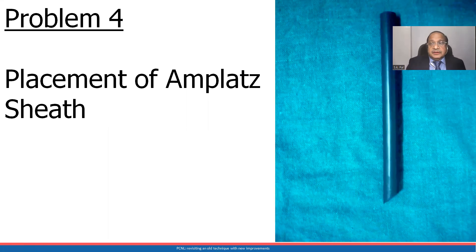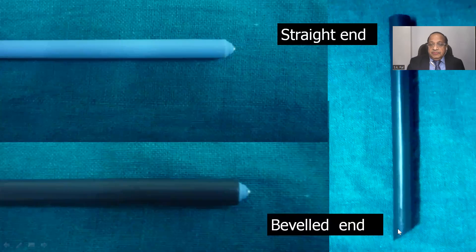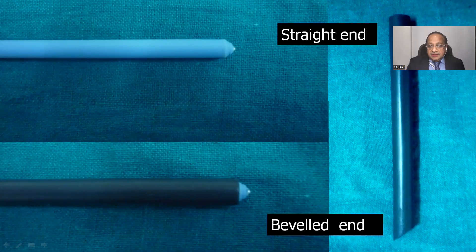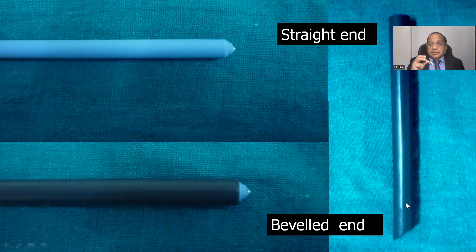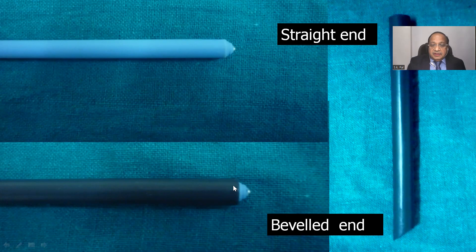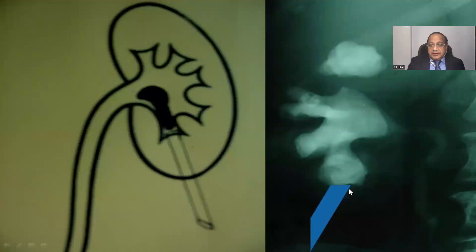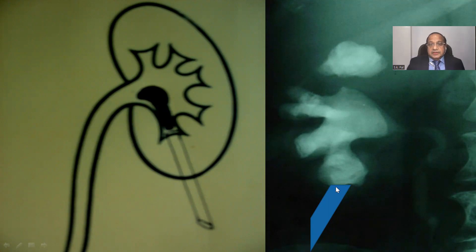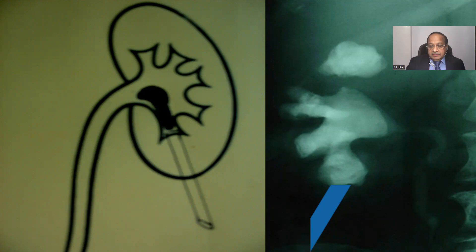Once dilatation is achieved, how do you place the access sheath? The access sheath has two ends: one straight end and one beveled end. If you pass the beveled end as we usually do in all PCNLs, this portion will come into contact with the stone and part of the sheath will be hanging outside. In situations where the stone is completely filling the pelvicalyceal system, you should pass the straight end inside, dilating up to the stone, so the access sheath is right up to the stone. There will be tamponade all around, and you can start breaking and removing the stone. In such situations, put the access sheath in the reverse way to get good control and good tamponade effect.